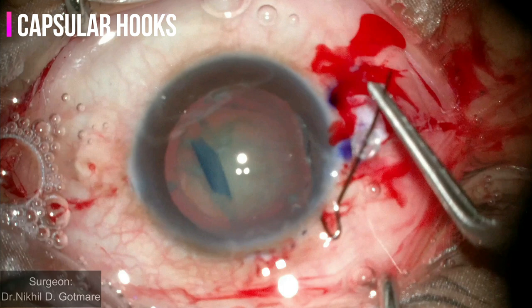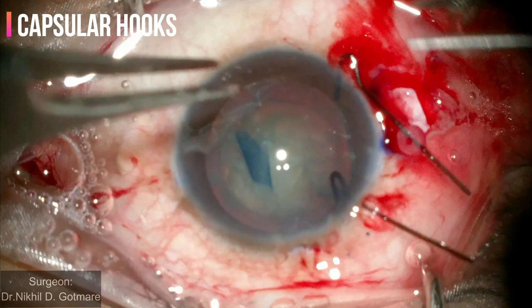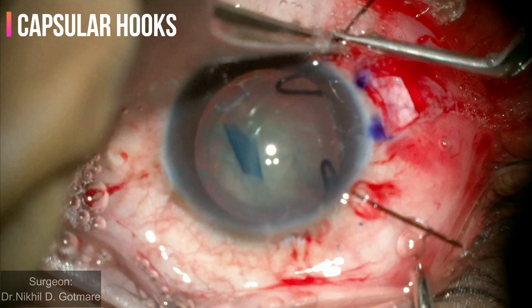Capsular hooks are applied in the area of subluxation to support the bag during phacoemulsification. These will now act like artificial zonules and prevent further subluxation. Iris hooks may also be used for the same purpose but carry a risk of capsular tear.